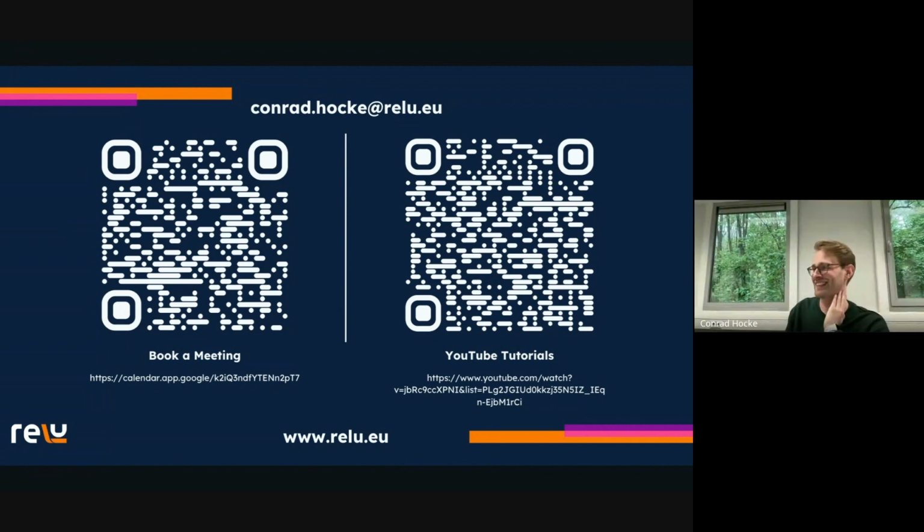Right, thank you, Antoine. And David, yeah, we realized that the incisive nerve canal can be quite important for orthodontics. And we've already worked on a solution for that, but as of now, it is not available. But I will send you an email after the webinar, and then we can maybe have you test the feature or something and look into it more.